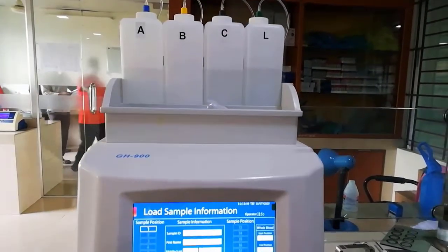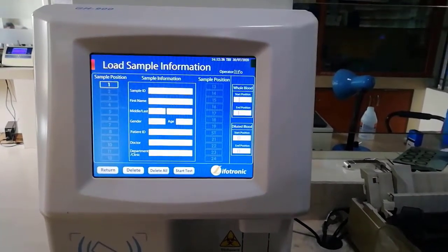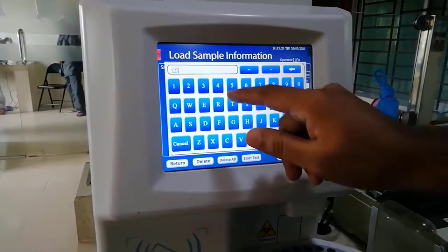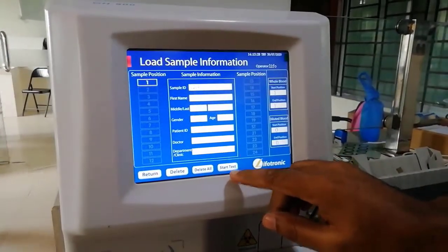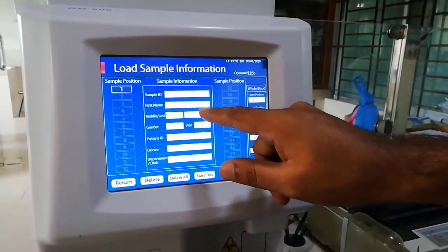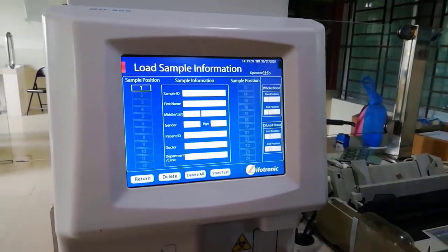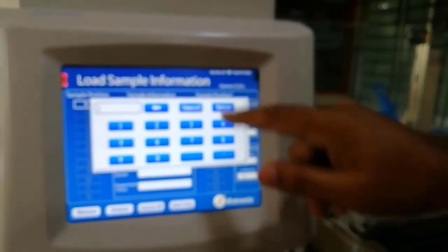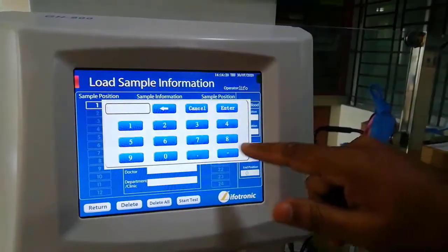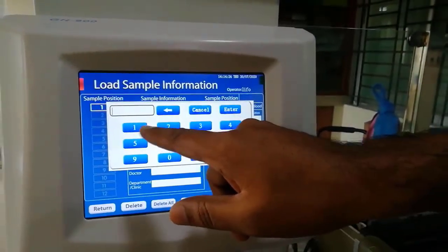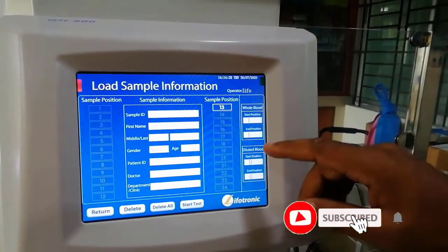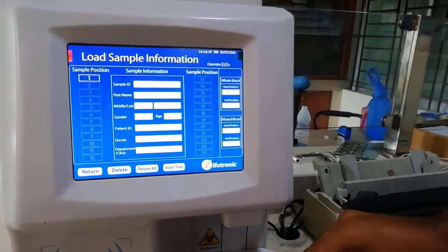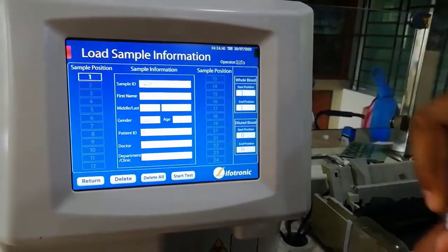I am going to run a test as an example. Sample position one — enter sample ID, first name, middle name, gender, and patient ID. Once all fields are filled in the start position, press Start.